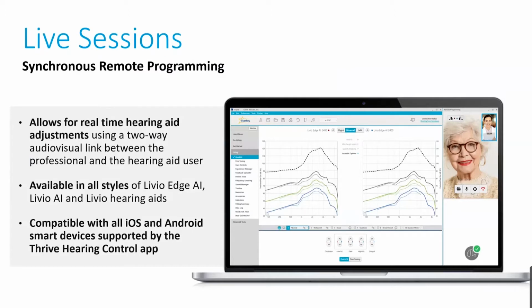As I said, Hearing Care Anywhere live sessions is available in all styles and technology tiers of Livio devices, including Livio Edge AI, Livio AI, and Livio. And it is compatible with both Apple and Android smart devices, assuming that they are supported by the Thrive Hearing Control app.